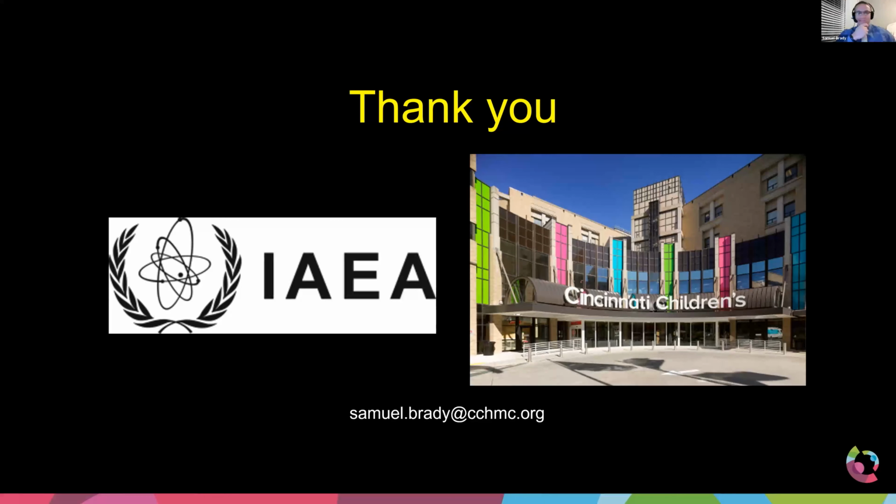Okay. Yeah. And that's especially when it comes to diagnostic reference levels. You don't actually set a diagnostic reference level for every protocol you have in the hospital. Obviously, there's just too many. And so for example, you'll pick the top 10 most used protocols, and that's the ones that you send out to all the hospitals in Thailand.